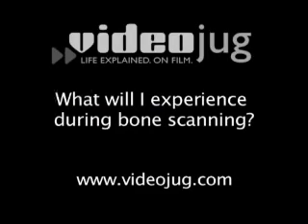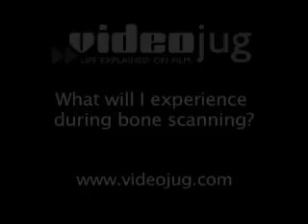What will I experience during bone scanning? There are really no specific sensations that occur during a bone scanning. Again, a small amount of pain at the time of tracer administration intravenously, and very rare possibilities of side effects or allergic reactions that we already talked about. But other than that, there are really no specific sensations that the patient may receive during a bone scanning procedure.